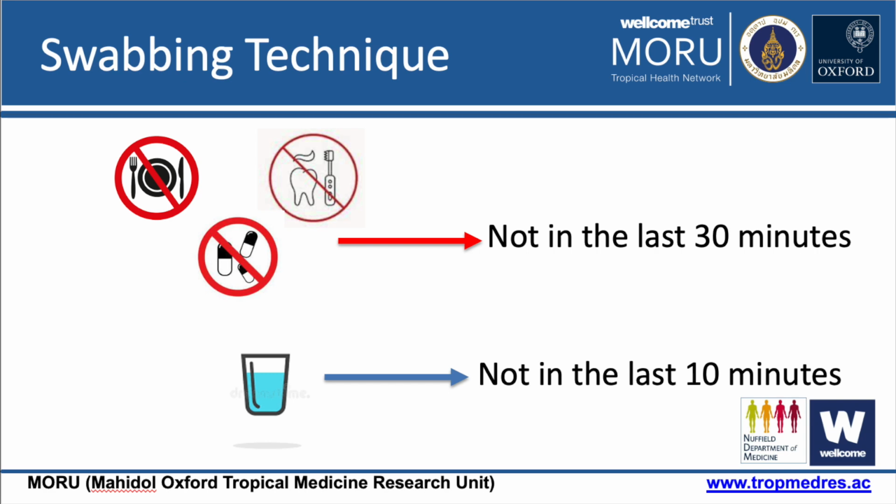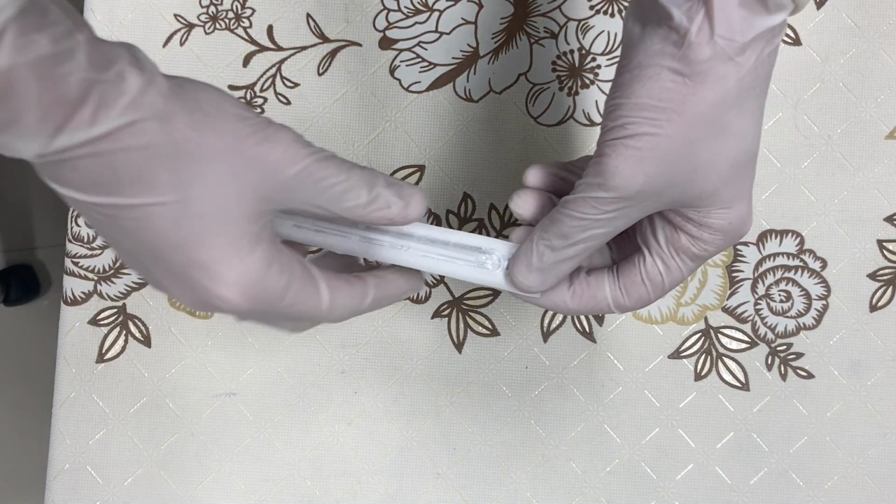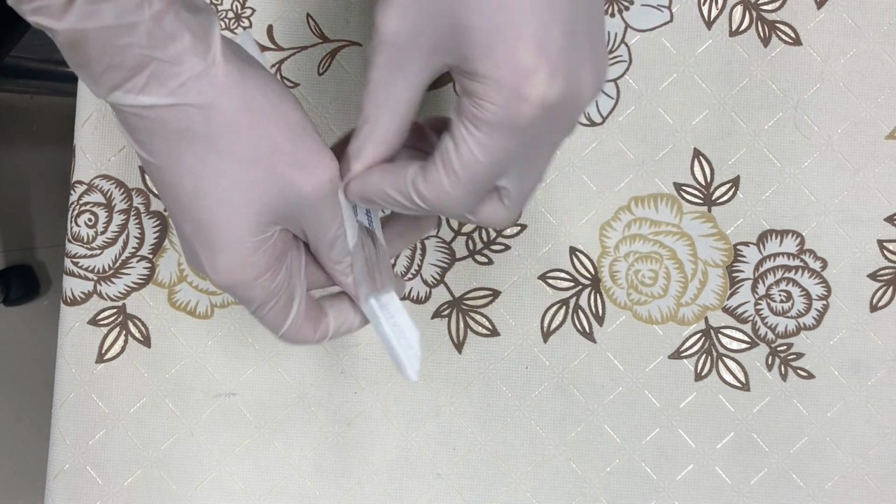Make sure the patient has not eaten, had a drink, taken medications, brushed their teeth or used mouthwash in the last 30 minutes. Plain water, not hot, drunk over 10 minutes ago is okay. Take the left throat swab first. Remove it from the packaging carefully.